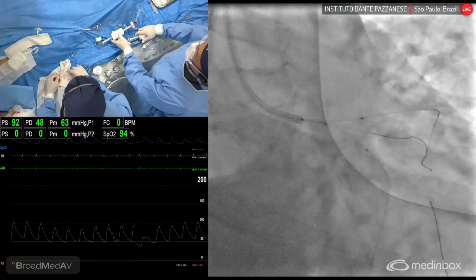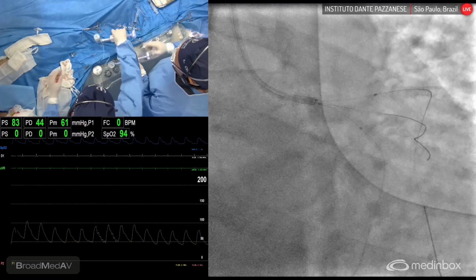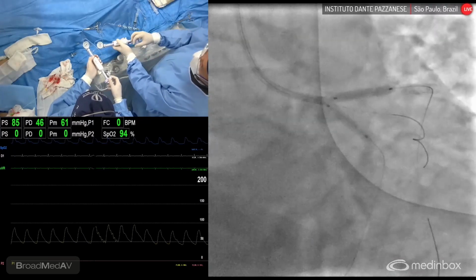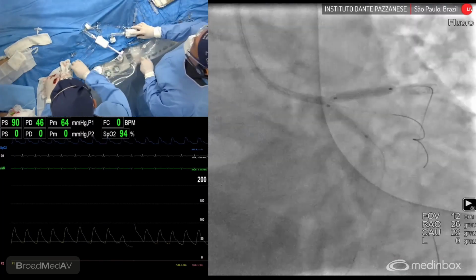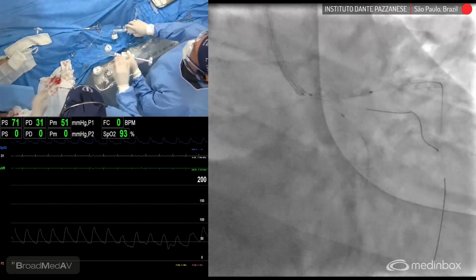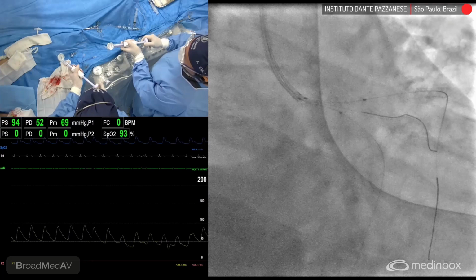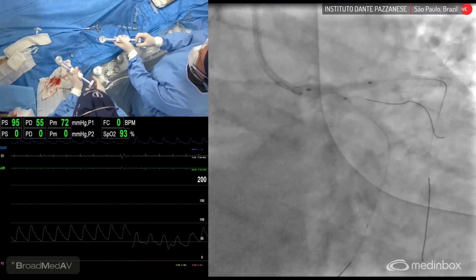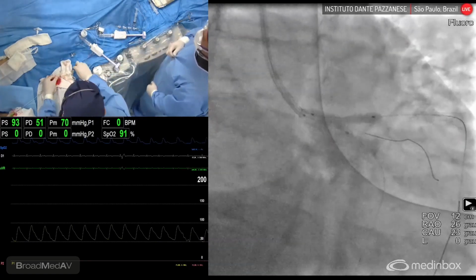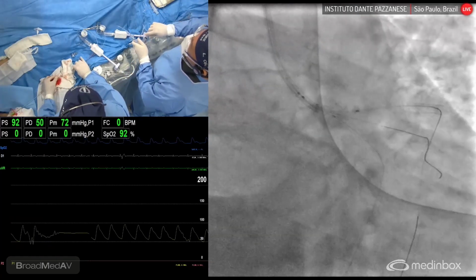Okay. Perfect. Okay, so the balloon slipped a little bit, that's some calcification. Yes. And then you're going to advance the stent, right, Rodolfo? Just doing another kissing, okay? Oops. Okay, you can see here the narrowing, so some reaction here. Great. And pulling now out the balloons, and then you're going to advance the stent.